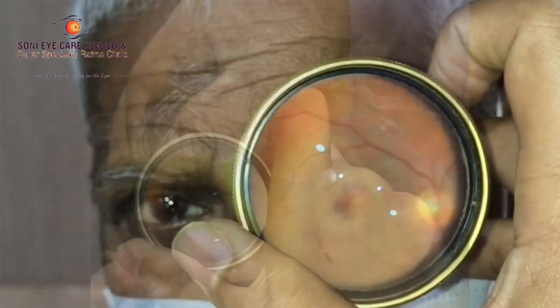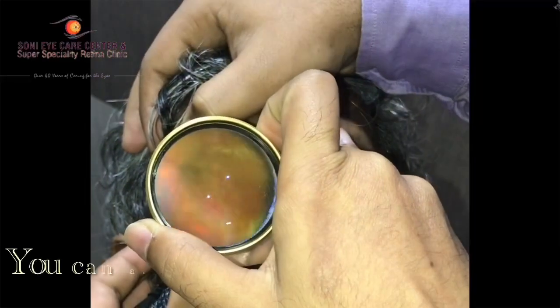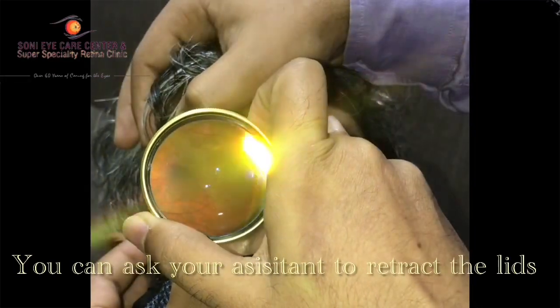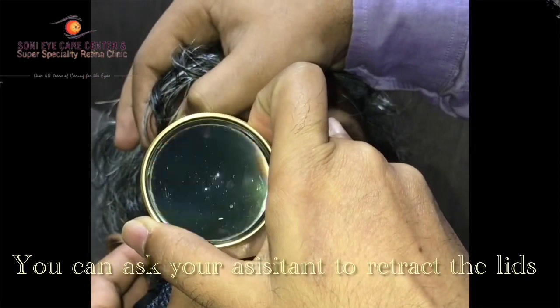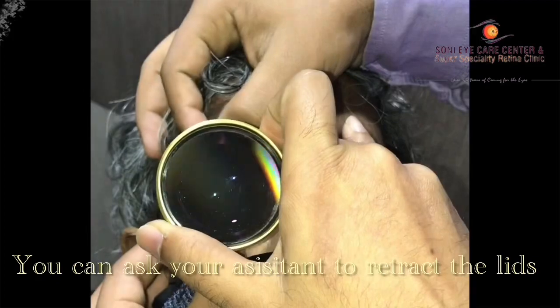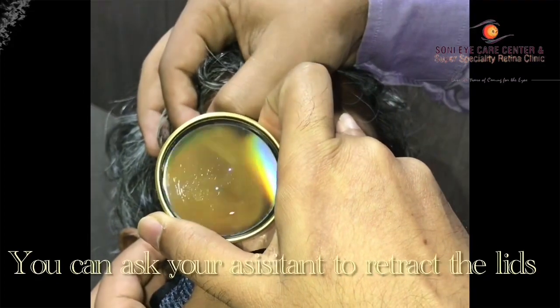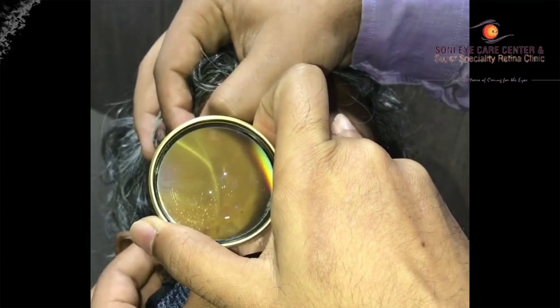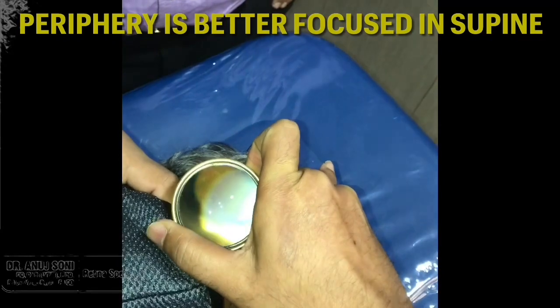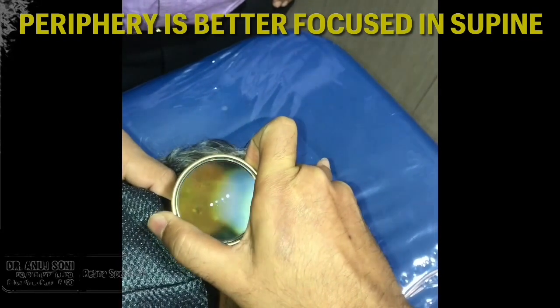You can take help from the assistant to retract the lid. Video can be recorded in the sitting position, and in some cases the supine position may be needed when we need to focus on the periphery.